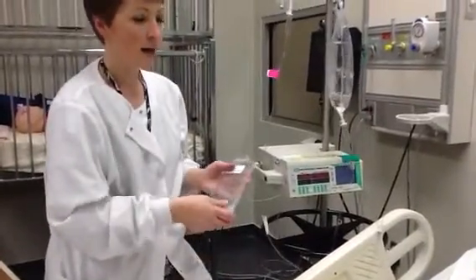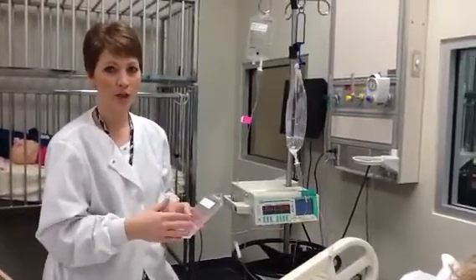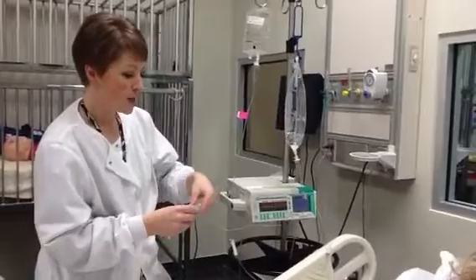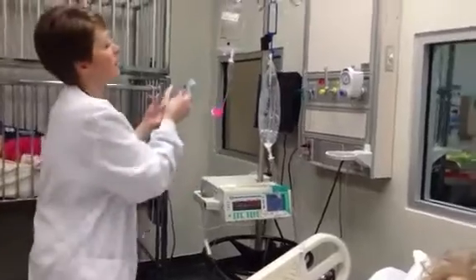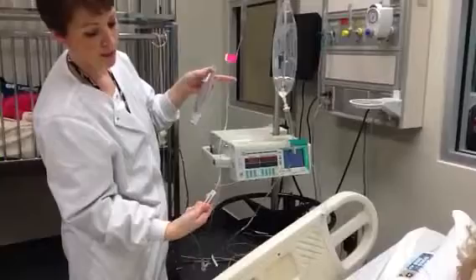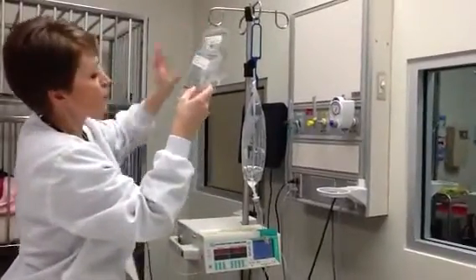So we again have done all of our checks. We verified the medication, we verified our patient, we've done our hand hygiene, and we're ready to prepare our solution. So I'm going to open up my IV port, and I'm going to, first of all, make sure that my tubing is clamped down, and I'm going to change the bag over.